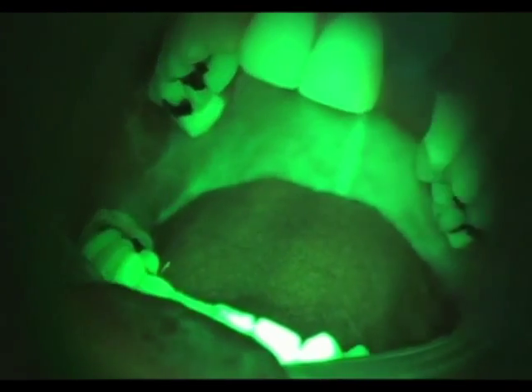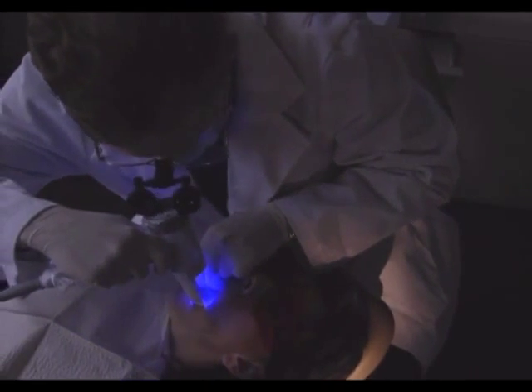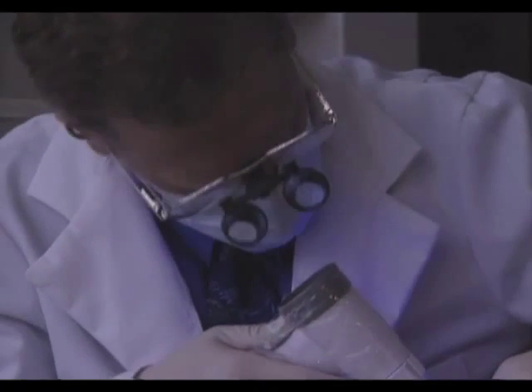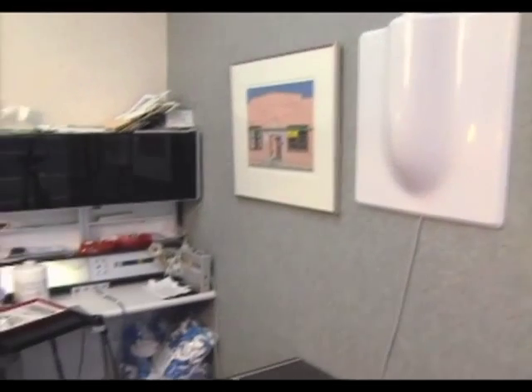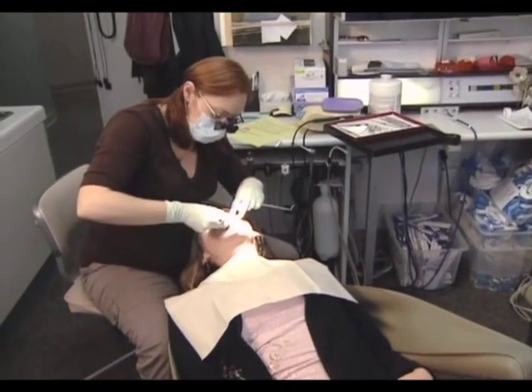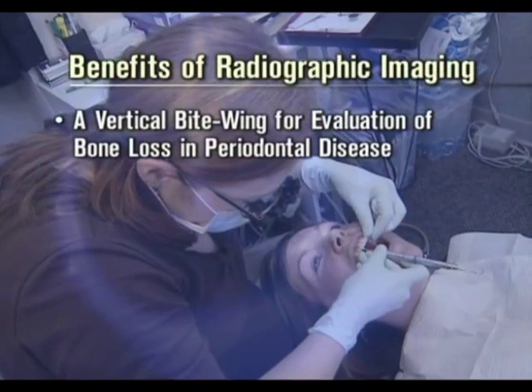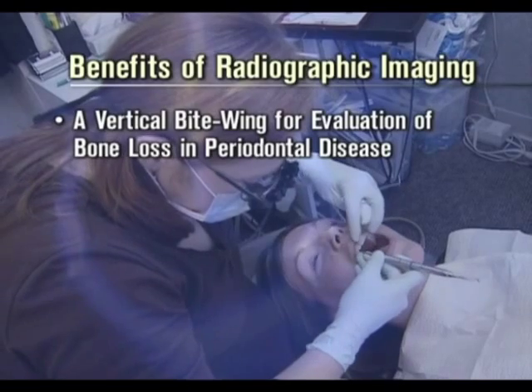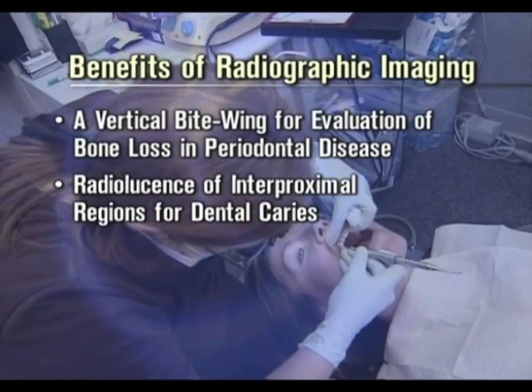Once an area of concern has been detected, the clinician focuses their attention on that area, looking for details on how it presents. This might be compared to how an additional periapical or bitewing radiograph might be utilized after an area is discovered on a panoramic image. This additional radiographic view is beneficial to facilitate investigation of disease not readily perceived by the human eye — for example, a vertical bitewing for evaluation of bone loss in periodontal disease or radiolucence of interproximal regions for dental caries.